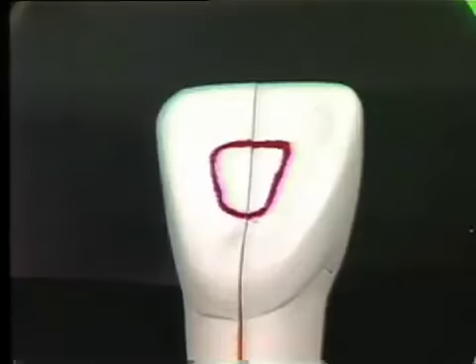There's only one way to get into the pulp and fulfill all of these requirements, and that's to remove the entire roof of the pulp chamber. If we remove the entire roof, we'll be able to have access to clean and instrument not only the pulp chamber, but all of the canals. Since we're not touching the walls of the pulp chamber, the tooth won't be weakened unnecessarily. Let me show you what I mean by this.